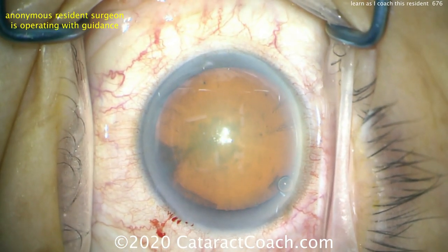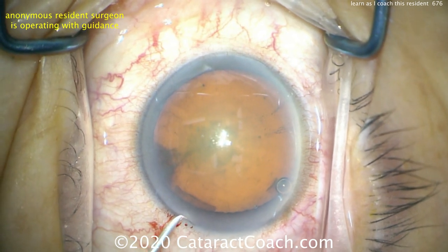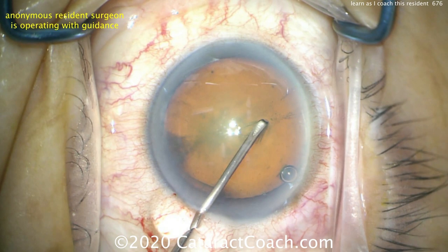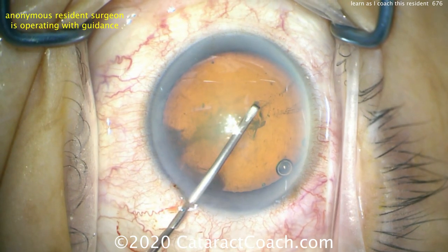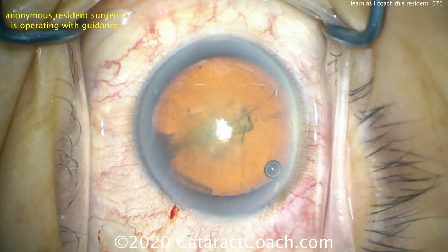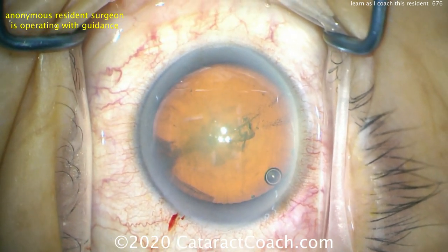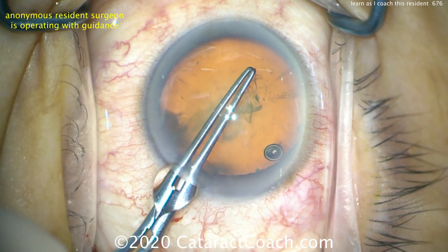Let's go now and make the capsulorhexis. A lot of residents like to start off doing the capsulorhexis with a cystitome, and that's perfectly fine — I don't do that, but many people choose this as their preference. So that looks good. Pivot with the incision now, and tear across — let's get this flap flipped over. Push a little bit more. Very nice, a little bit more. Good, so that's a flap that you can now grab. Good job coming in and out of the incision. Here come the forceps.